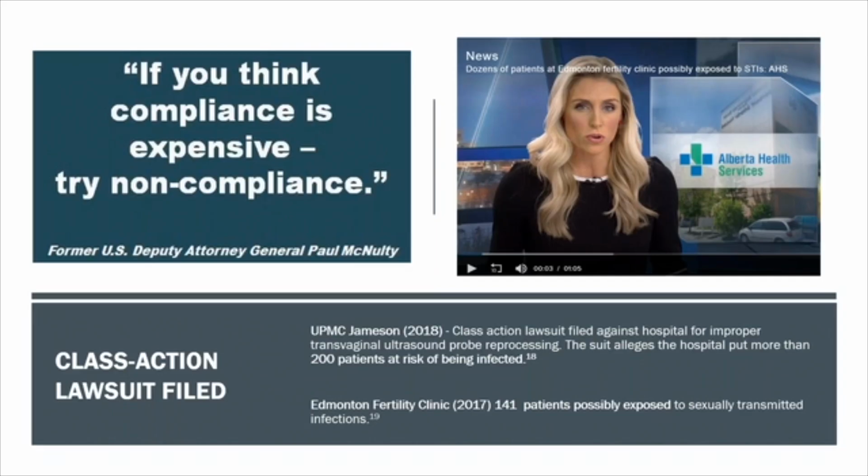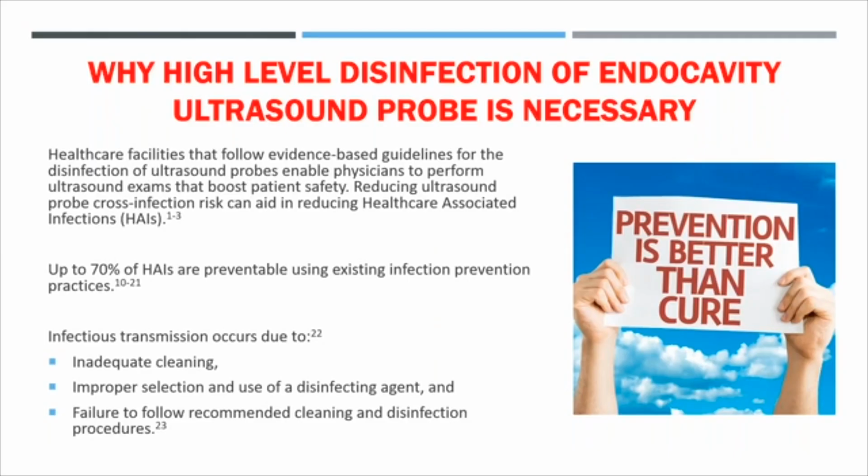This is from a U.S. Deputy Attorney General. In the United States, failure to perform correct disinfection has led to substantial legal risks, expensive lawsuits filed against hospitals as well as individual practitioners for improper probe disinfection and putting patients at risk, as well as another case of patients possibly exposed to sexually transmitted diseases. So this is why disinfection of endocavity ultrasound probes is necessary.